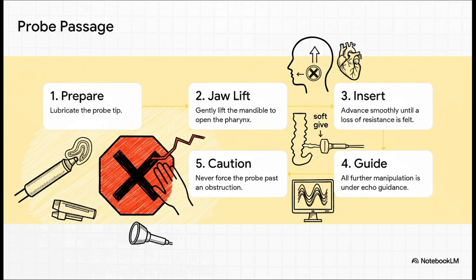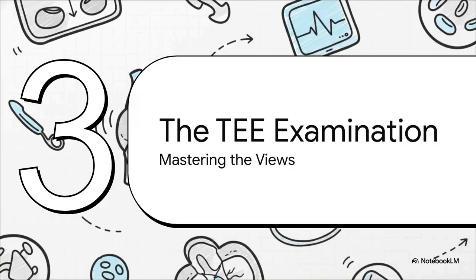Once you're in, all further manipulation, advancing, withdrawing, flexing, should be done while you are actively watching the echo screen. And I absolutely cannot stress this enough. The most important rule is right there in bold. Never, ever force the probe if you meet resistance. It is so much better to stop, withdraw, and reassess, even use a laryngoscope if you have to, than to risk causing a perforation.